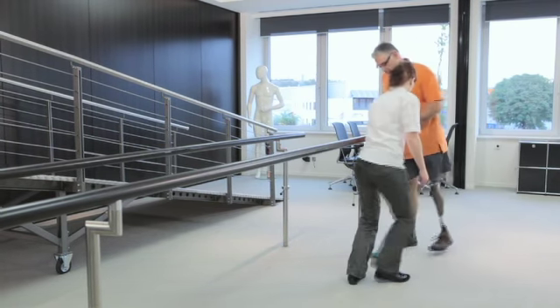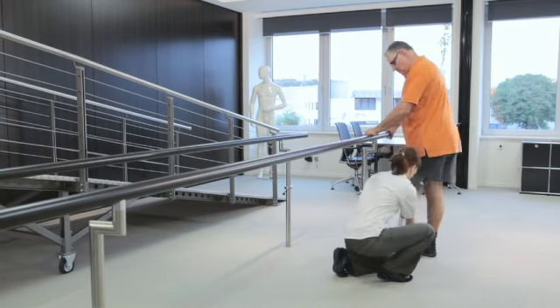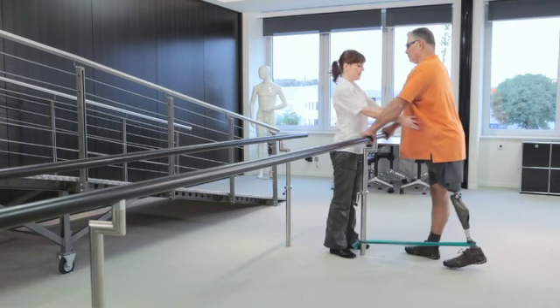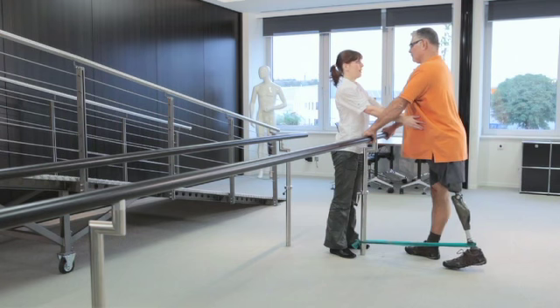A second exercise is performed while the user is wearing the prosthesis. Bend an elastic band around a stable object. The other side of the elastic band can be put around the prosthetic foot. Have the user move his prosthesis backwards. This exercise could also be performed during physical therapy at home.